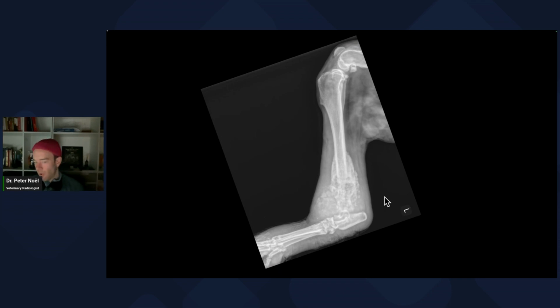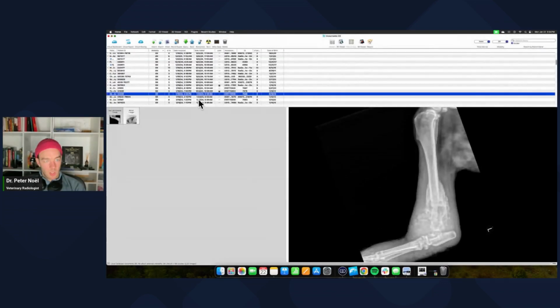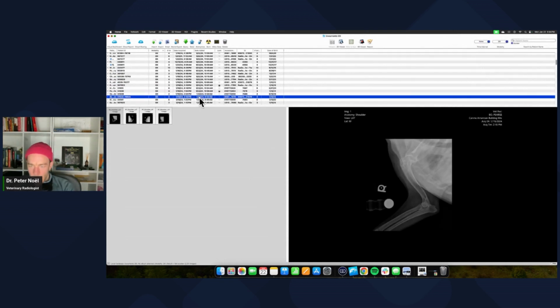You don't need to have all of those features to say it's aggressive. If you have an irregular periosteal reaction, an irregular periosteal proliferation, you've got a feature of aggressiveness. So this has a lot of the features of aggressiveness. Location is important. Do you have any of the features of aggressiveness? Looking for mets, the location, monostotic versus polyostotic, and the age of the patient are all helpful. Okay, let's do another case.